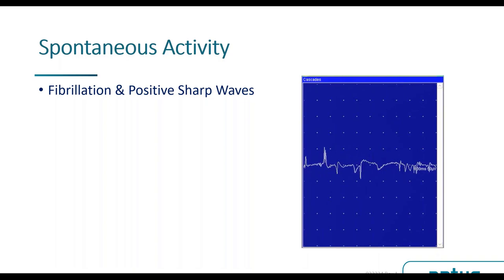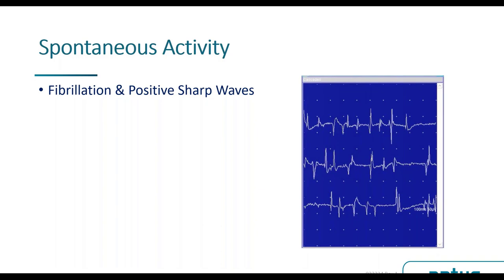Now, this is an important measurement, and it is quantified in two ways. One is a numerical scale, 0, 1 plus, 2 plus, etc. Notice that if you have abnormal spontaneous activity, fibrillations and positive sharp waves at one site, only one site, that is normal. That's an important distinction between 1 plus and having one site. 1 plus means that you need to have more than one site. Anything that happens just only once, one random observation, no matter how abnormal it is, we tend to downplay it.